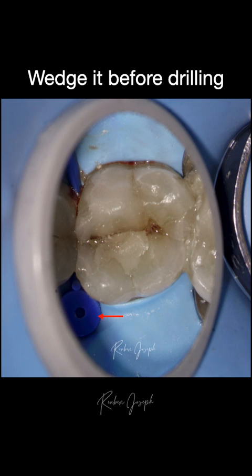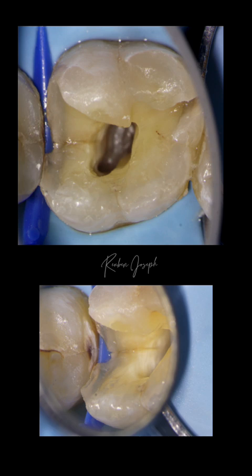So what I do when I anticipate a deep cavity is I stick a wedge in between the teeth proximally. The wedge holds the rubber dam down along with the gingiva well below the level of the defect. Here it is a crack, but the same thing applies when you have deep caries in the proximal area as well.